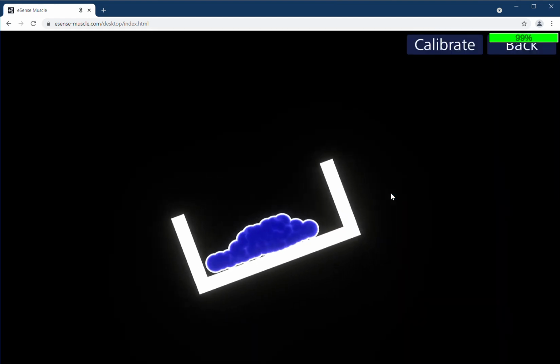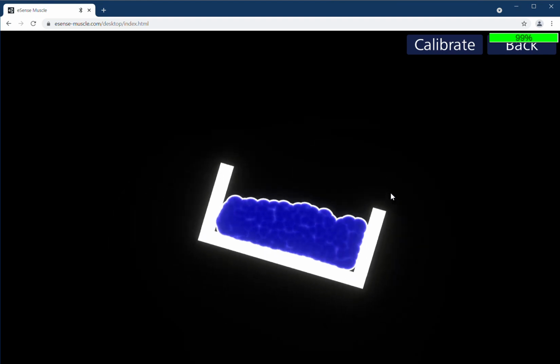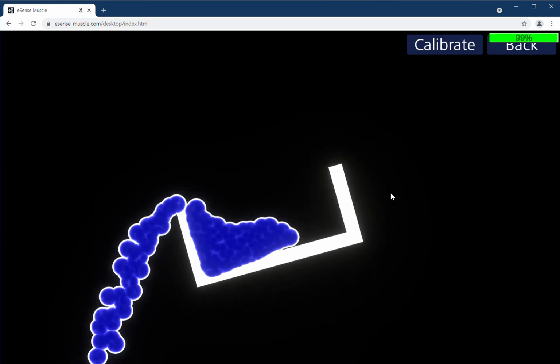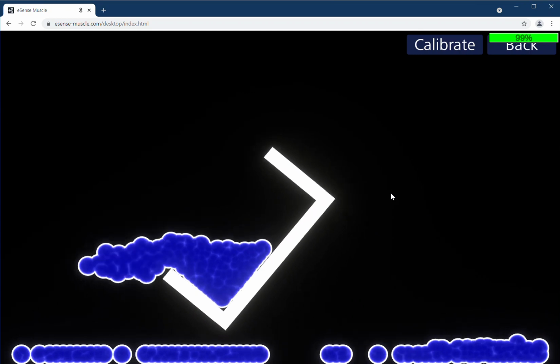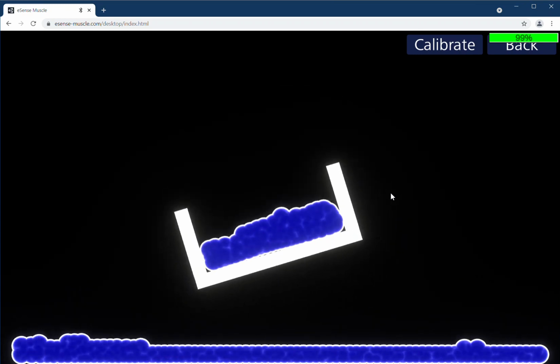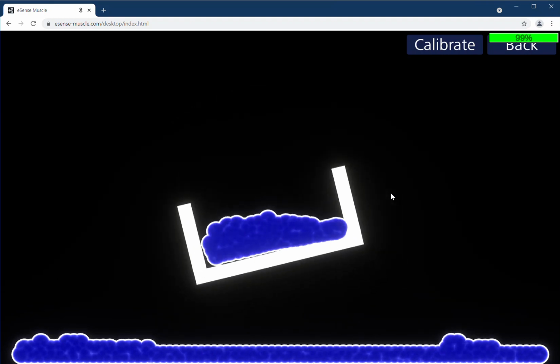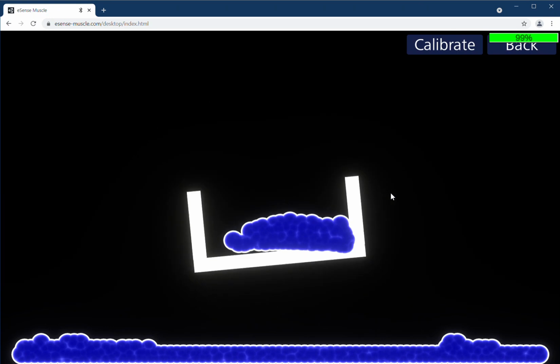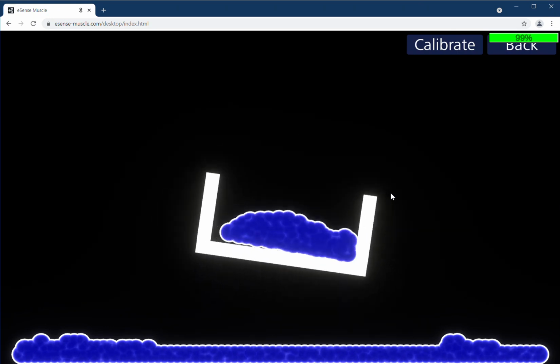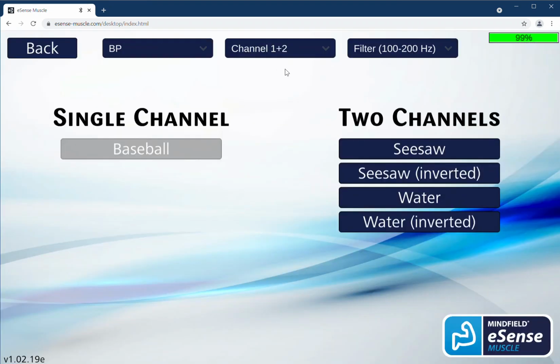In our water animation, you have this virtual water glass here. And now the goal is not to move it like that. Now I'm doing that on purpose, and not to spill the water out of this glass. So you need to keep that in balance, and you can also play around with this little water in here, as there is a little physics going on here. Okay, this is just the seesaw and water animation.